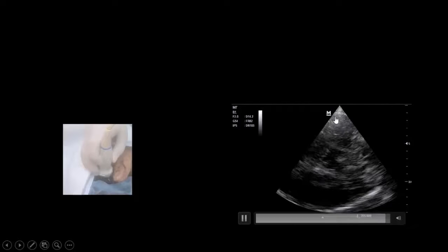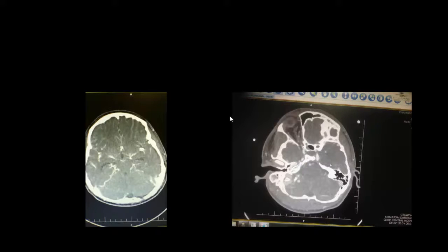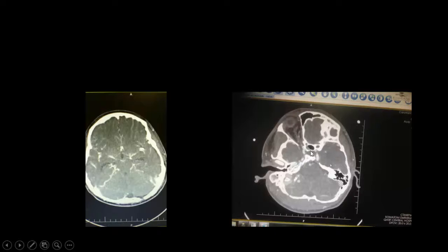The phased array probe is at 30 degrees from the horizontal and you tilt until you get this butterfly appearance of the brain. Sometimes it is difficult, so you can rely on another clue — the bone of the skull. You will see the lesser sphenoidal wing, the apex of the petrous pyramid, and the upper ridge of the petrous pyramid. This curve is a very important landmark in transcranial Doppler, and the brain stem with vessels all around it will be visible.